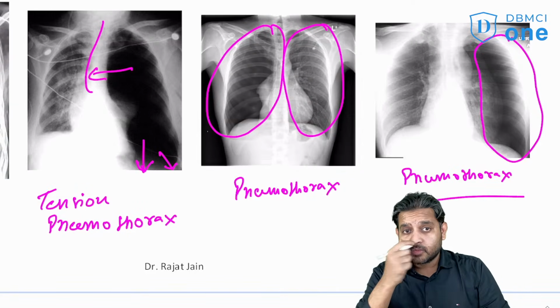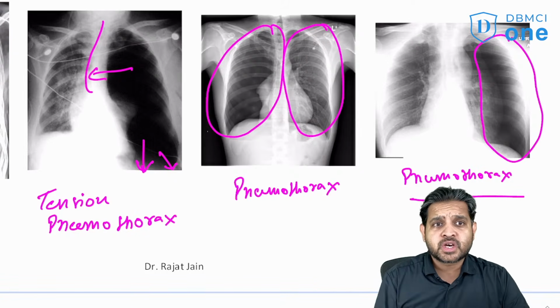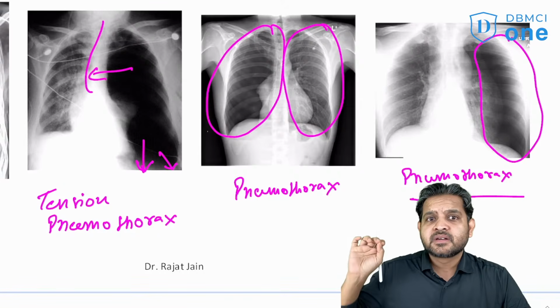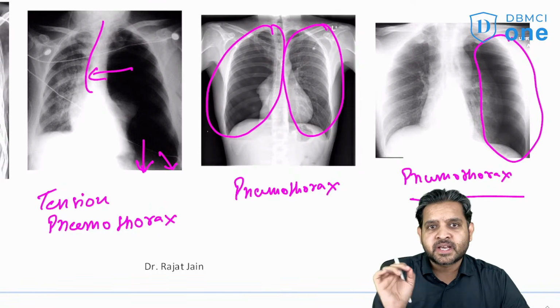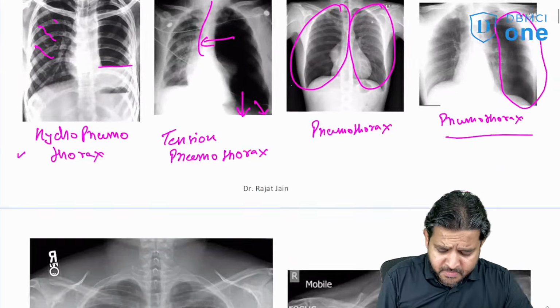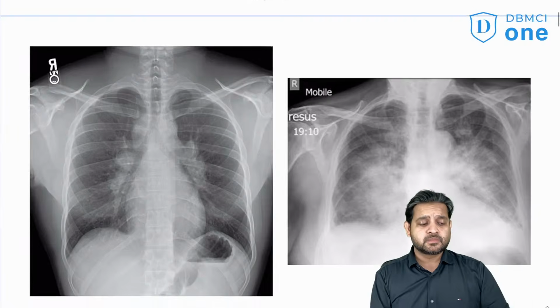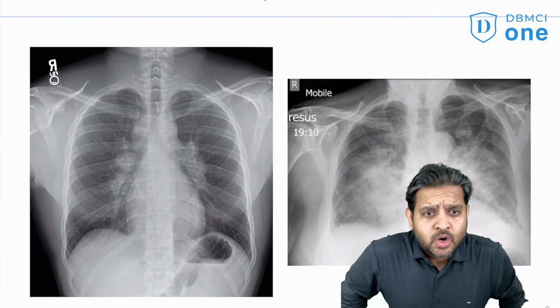Do that promise: pneumothorax, hydropneumothorax, tension pneumothorax, pleural effusion, any device, any lead, if it is there, you are able to answer it on a chest x-ray. This is a free mark, please capture it. Now let us look at some of the diseases on the chest x-ray.